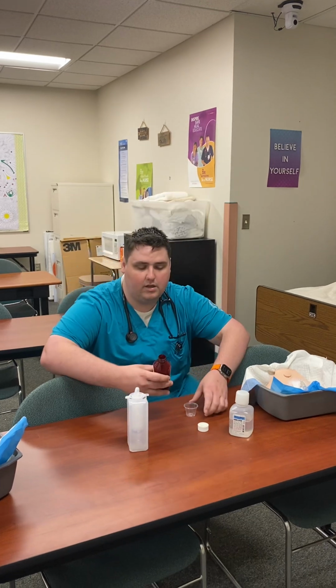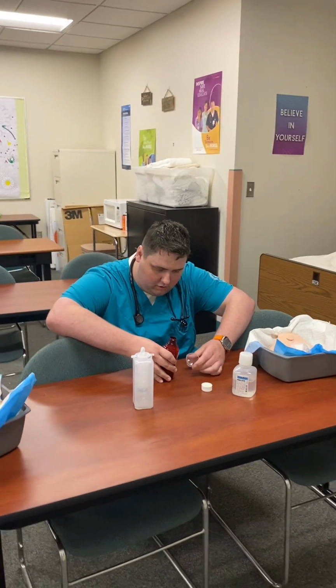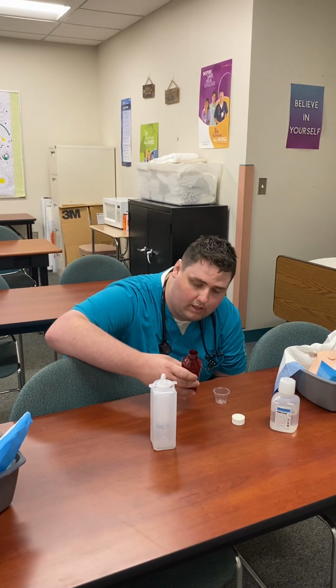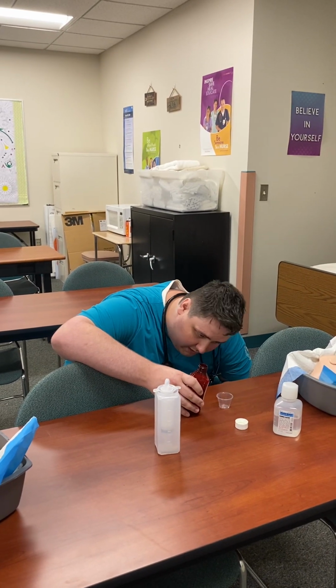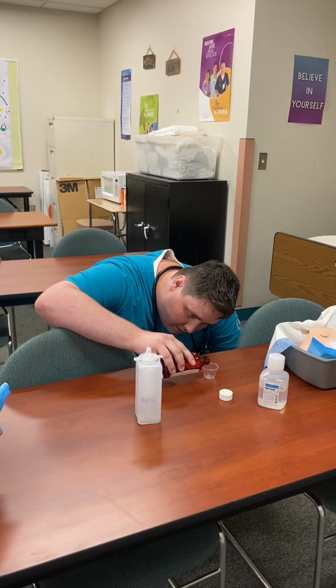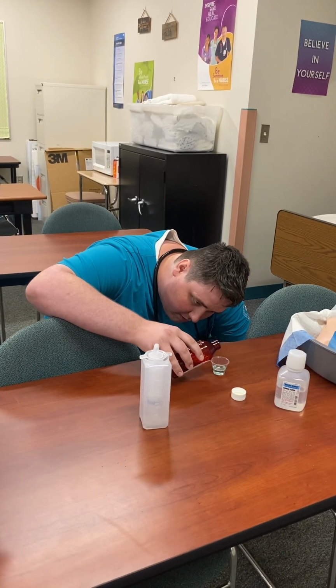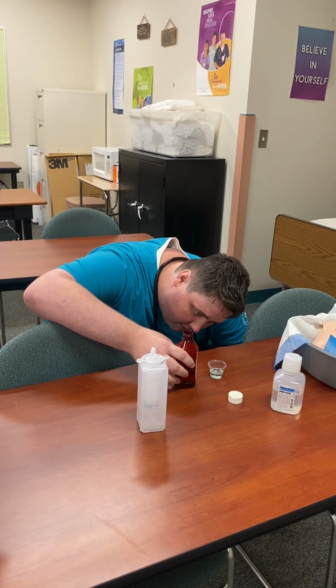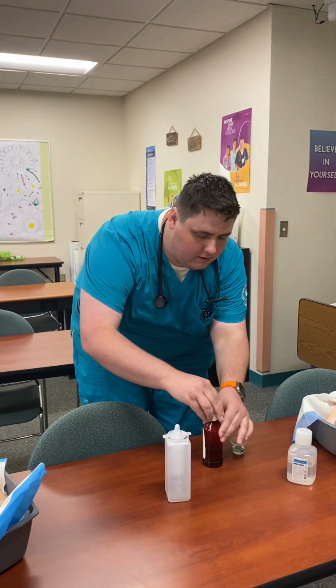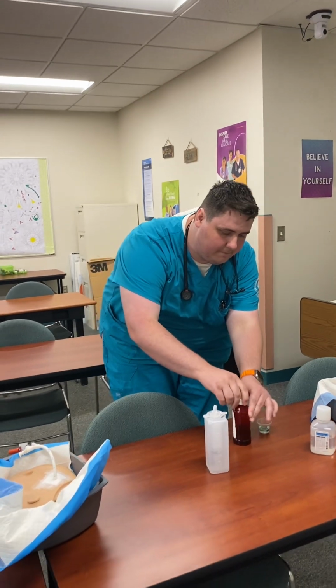When delivering liquid meds, you want to verify the amount that you need to pour and be at eye level height. For this case, we're going to pour 10 milliliters of the scheduled med, upon which you verify that you have the correct amount, cap your med, and return it.